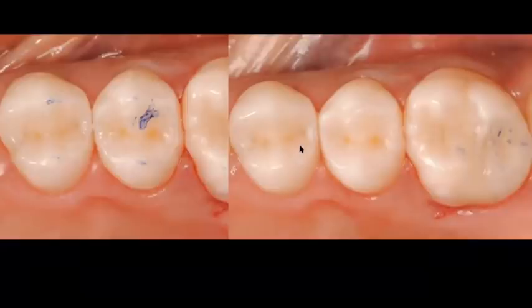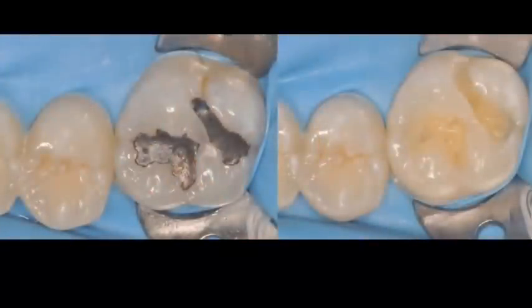I literally created this anatomy with an Explorer, so there's really no need for me to have any special burrs to get in here and recreate nature, because I did it from the get-go. I did it starting out with my successive cusp buildup technique. And that technique, and I'm going to share with you another case, enables you to build each portion of the tooth individually, so that when you finish your restoration, you have something that looks more like a tooth and not something that is completely flat, that obviously is going to require more adjustment on your side, because the opposing tooth normally has cusps, and these cusps have to sit somewhere.